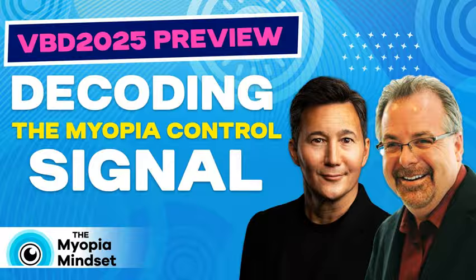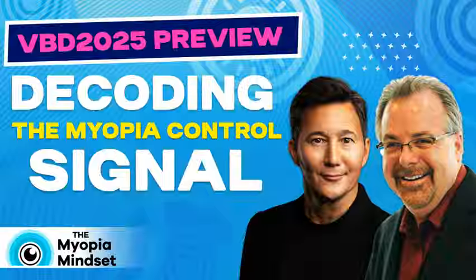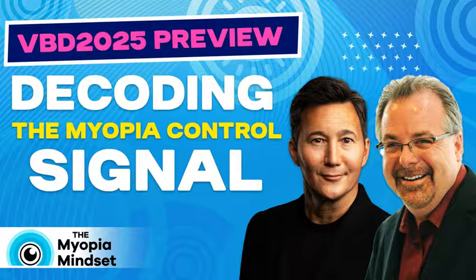Yeah, I would maybe step in and say Pat was one of the first to suggest that we should first look at the type of topographical response that we have and how a -3 effect could be different for one patient versus another patient. How's that possible when you're putting the same lens on both these -3 eyes and you get two very different topographies? So Pat suggested that, hey, maybe we could influence the shape that comes out by manipulating the optic zone sizes.